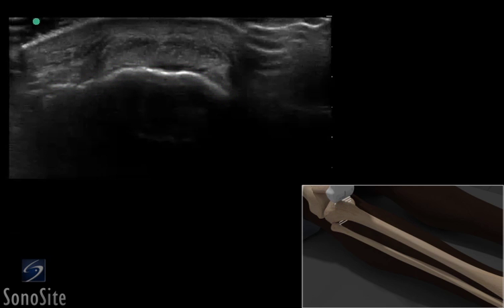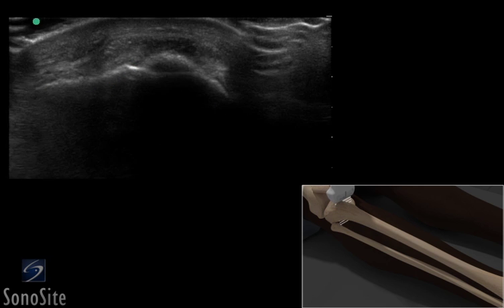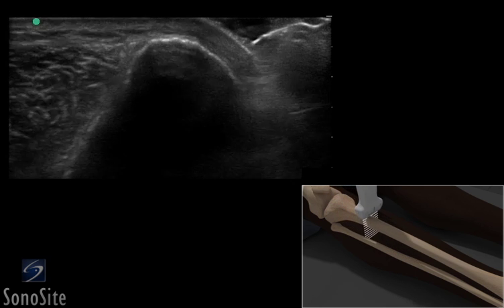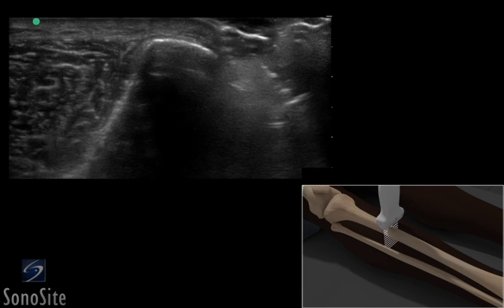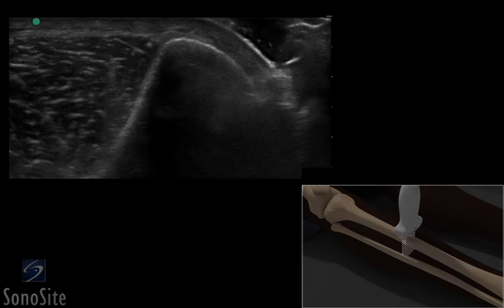The cross section of the tibia appears as a bright, hyperechoic triangular-shaped structure, which gradually tapers in the distal bone.